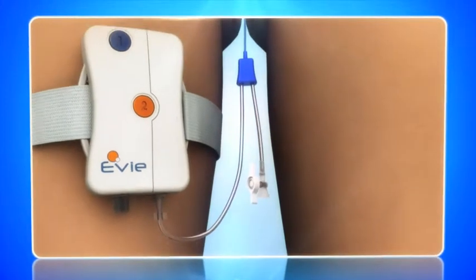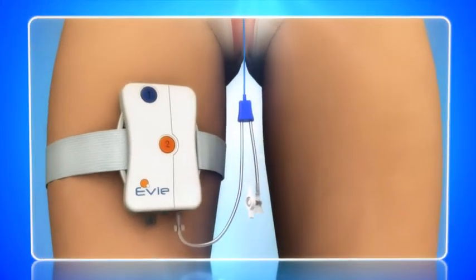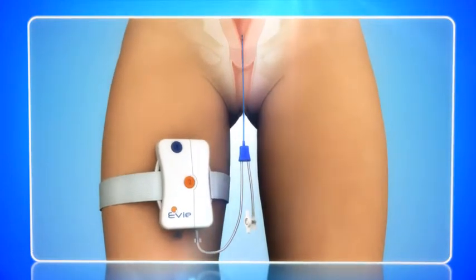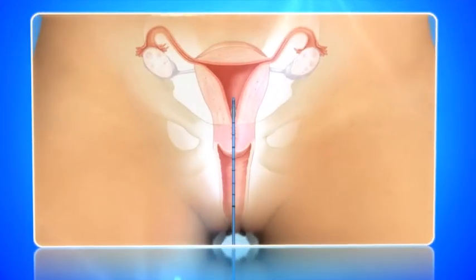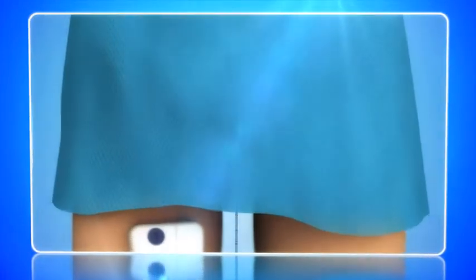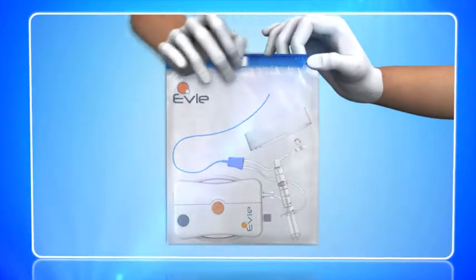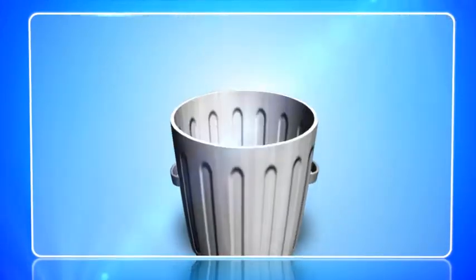You may see a small quantity of saline expelled from the balloon inflation line after the balloon is deflated. Gently withdraw the catheter. Release the leg strap. The EVIE and all the components should be discarded in the bag supplied.